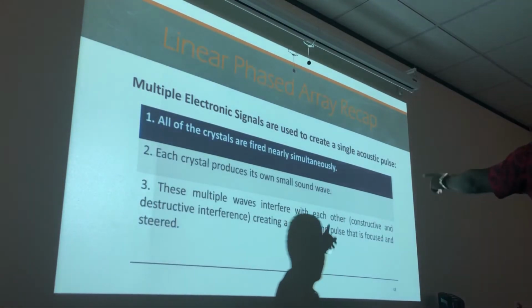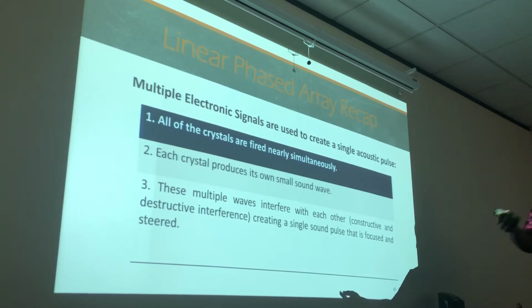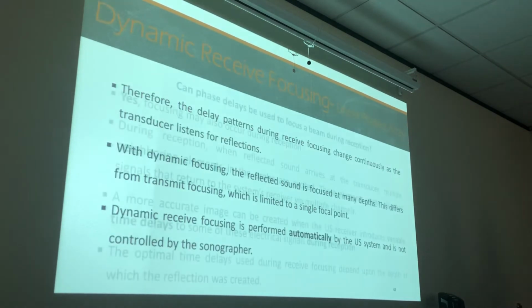What happens when there's damage to the PZT of a linear phased array transducer? Inconsistent. It can't be determined what's going to happen to that image. I think I even added that on there.